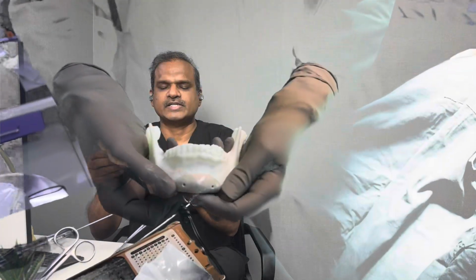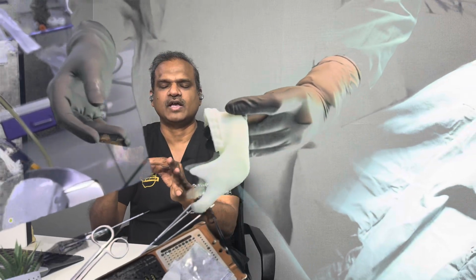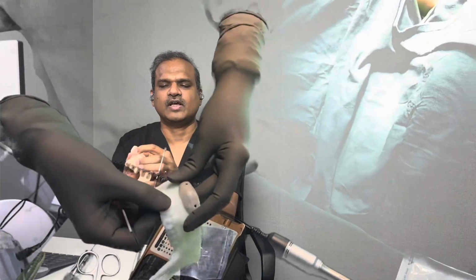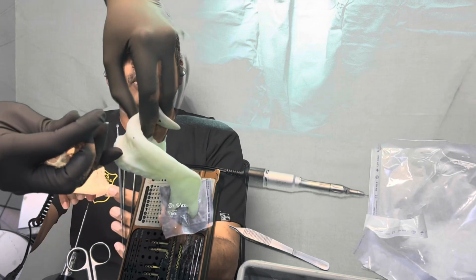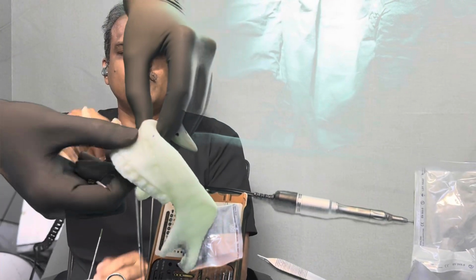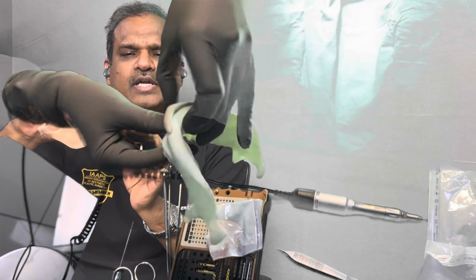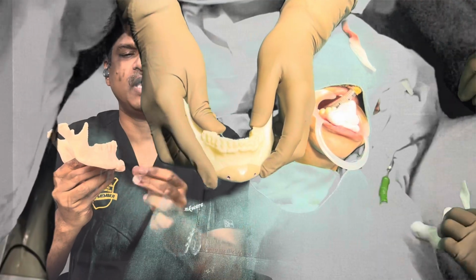See, this is a mandible implant, like a chin implant, which is forming the lower jaw. This is the chin part. Now if you see carefully, there is a forward extension and also a little downward extension. That is how we can plan how much downward and forward extension is required, which is adding beauty to the face. This is what I am telling.